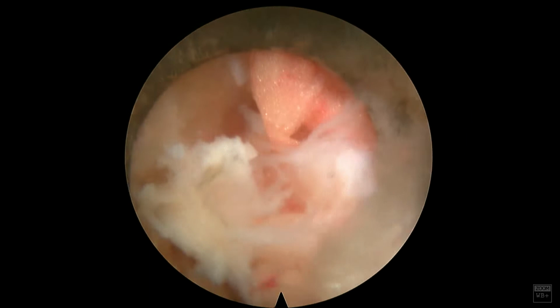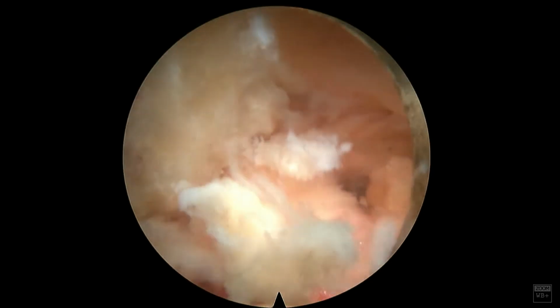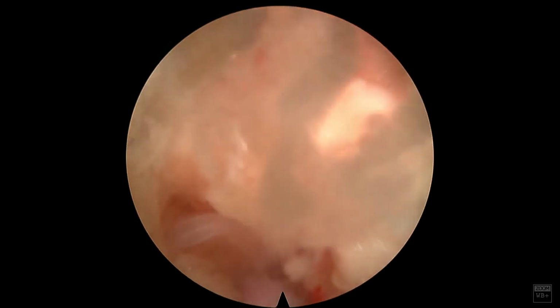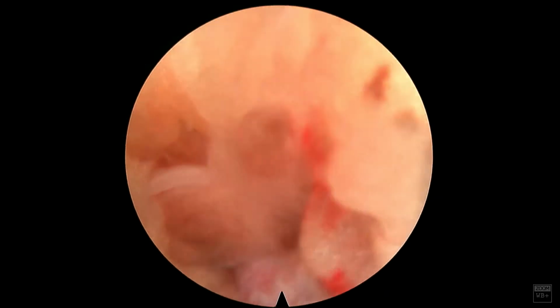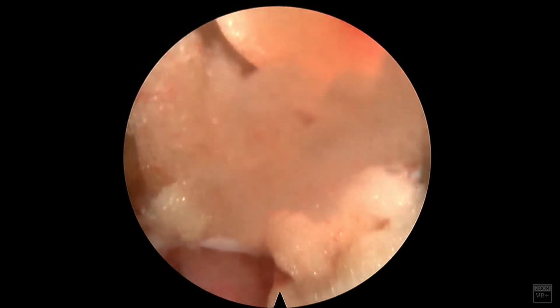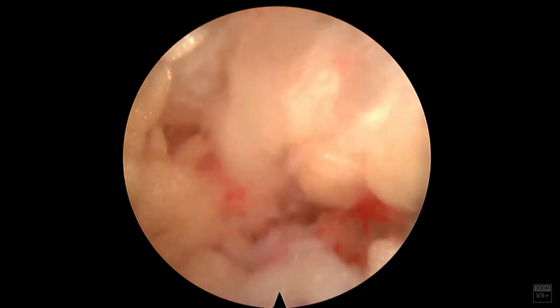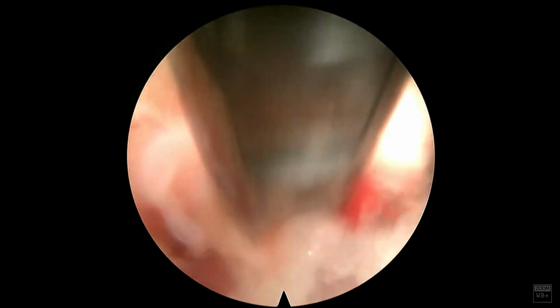Another question may be, how do you know what you're grabbing? Well, as long as I stay within my working tube, I know where the nerve is. I know that the exiting nerve is to the right of the working tube, protected under the, near the pedicle. I know that I'm right under the SAP, so anything within my working tube I can grab. As far as depth, I know that I'm not in the canal, so you want to not stray out too far from the working tube. There are certain bites that I do use that for, but I really know where I'm going.